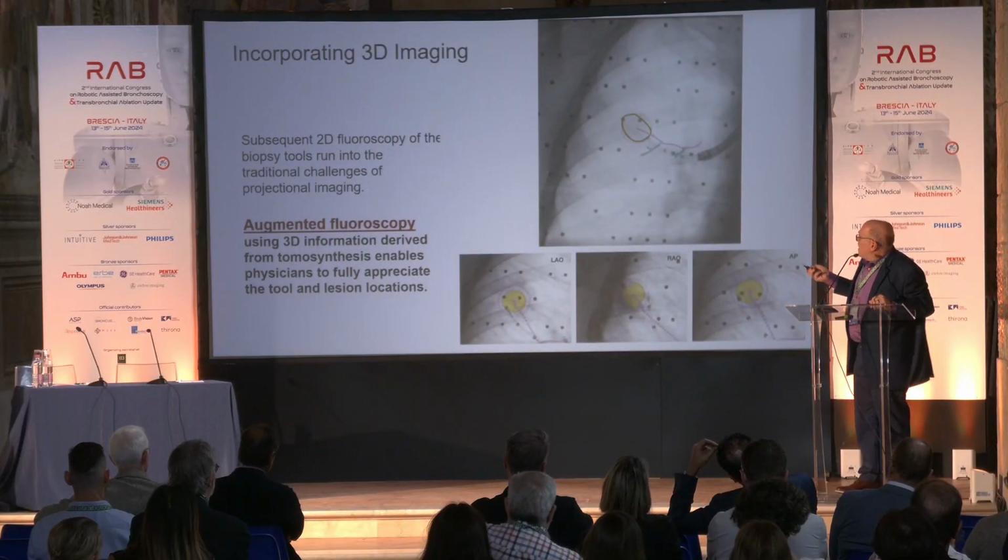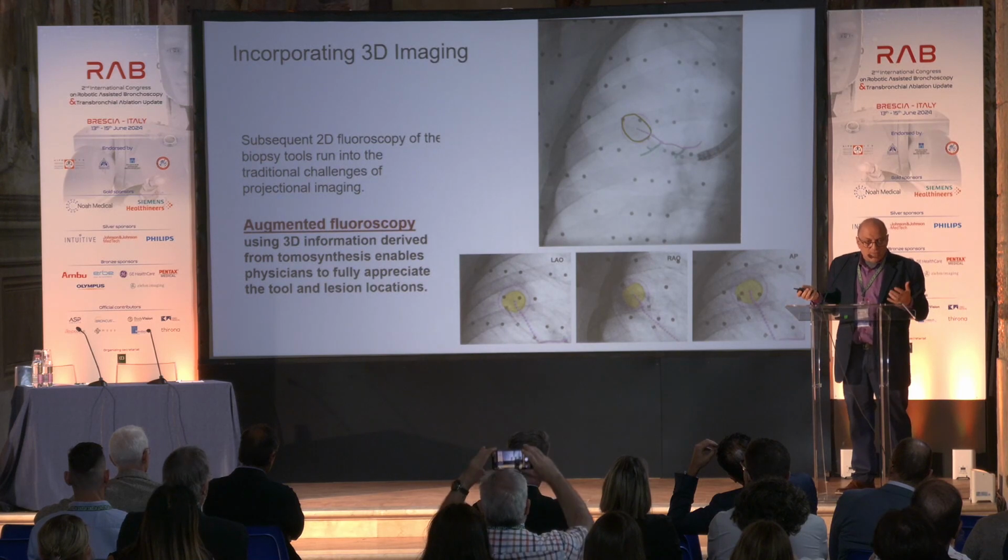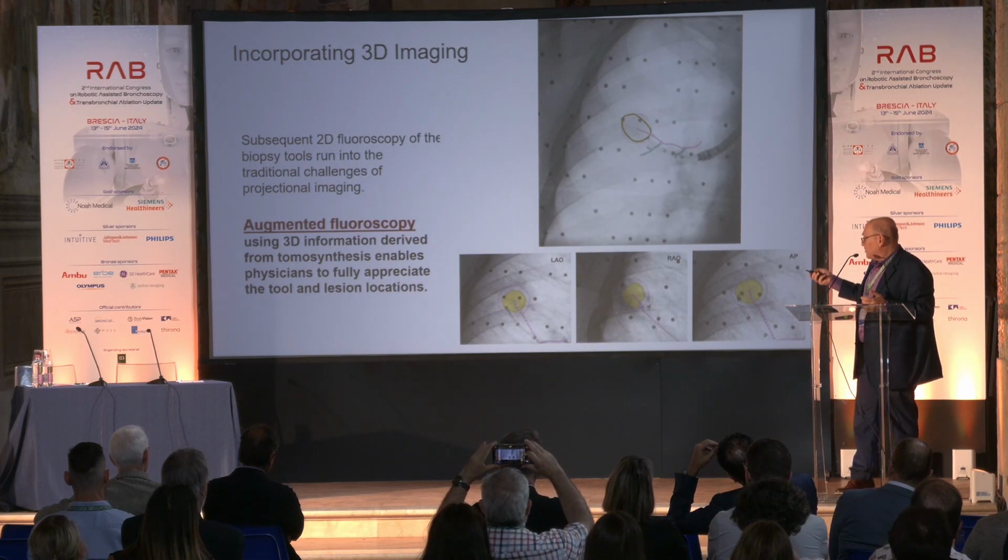This is the beauty and the power of augmented imaging, of augmented fluoroscopy. So you're not just sending a needle out blindly. Now, most of the time your needle will go where you want it to go, but if it deflects like the top one, what do you do? How would you even know that's happening? This is why we've created these platforms.